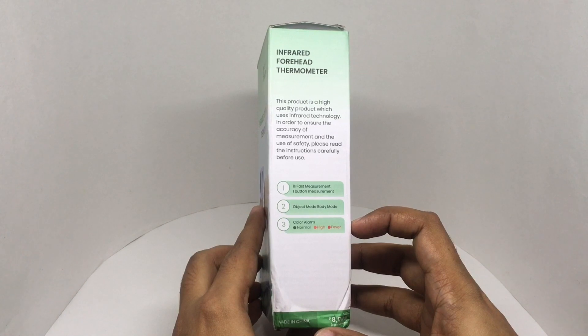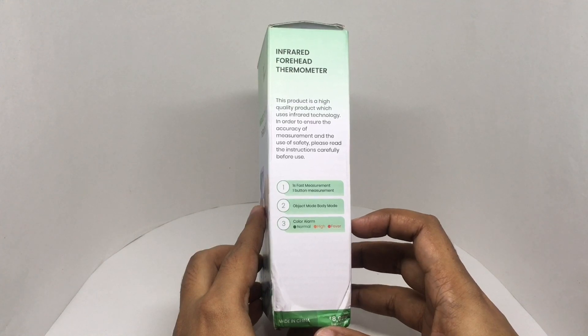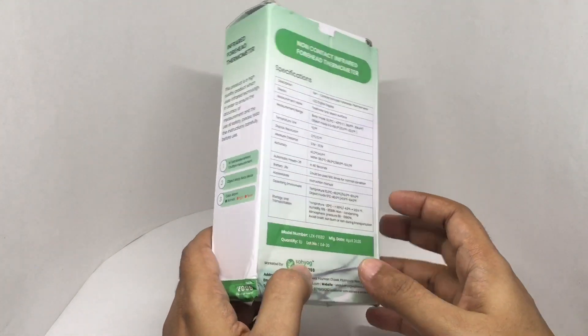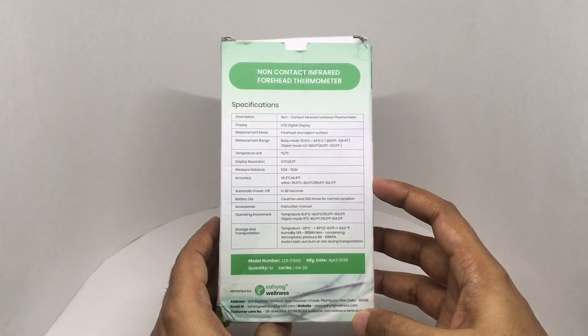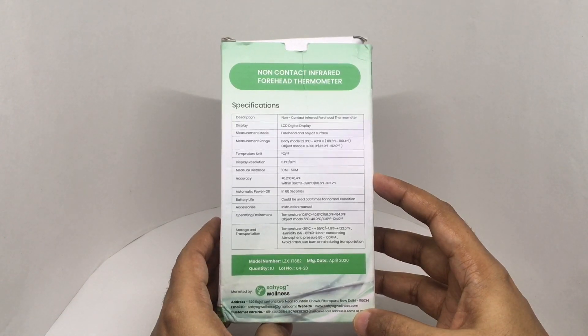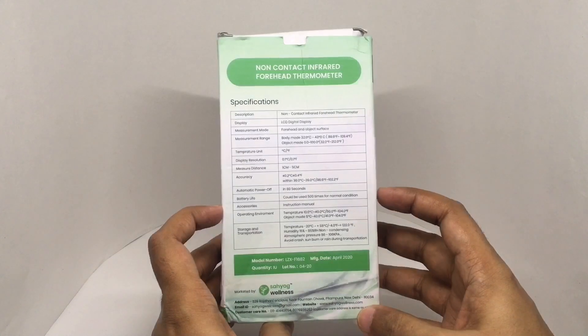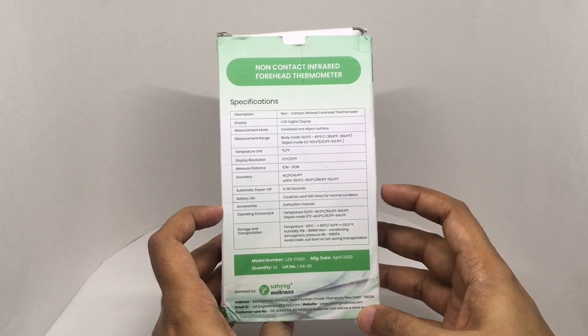The temperatures are color coded — normal is green, high is orange, and fever is red. The measurement range is 32 to 43 degrees Celsius in body mode, and 0 to 100 degrees in object mode. The measurement distance is 1 to 5 centimeters, and it runs on two AAA batteries giving you around 500 readings.